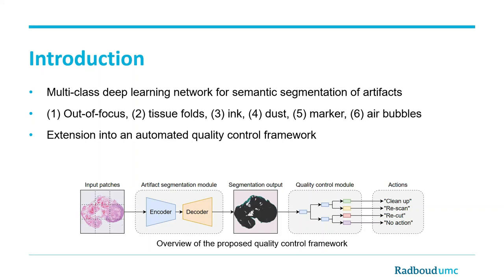An overview of the proposed framework is shown on the slide. The framework works as follows: a whole-slide image is split up into smaller patches. These patches are then fed through the artifact segmentation module. Then the individual patches are stitched back together into a full-scale segmentation map. The quality control module uses the segmentation map to return one of four actions, which can be used by pathologists to improve the quality of the whole-slide image for a more accurate analysis.